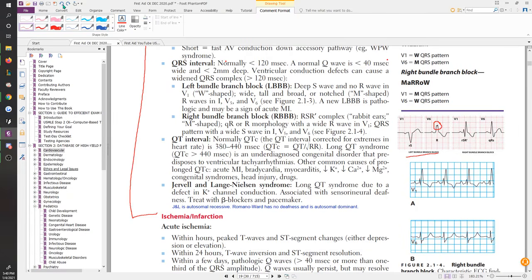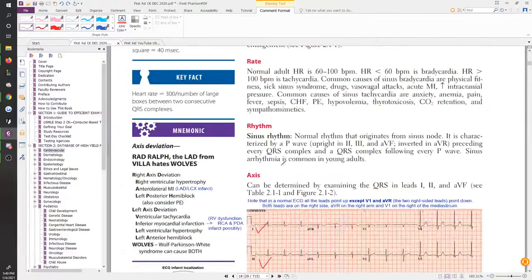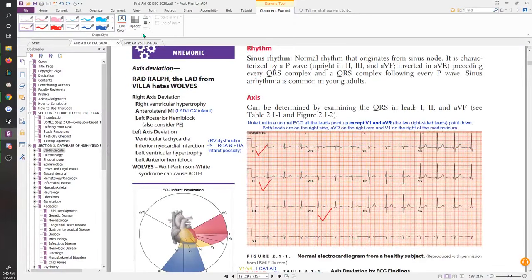So now, always recap this, right? Always recap this. As we initially started about visiting an ECG, we had multiple things to look at, right? We cut it in half. We did the R wave progression, right, to see how that's growing. We made sure that VR and V1 are the only ones pointing down.